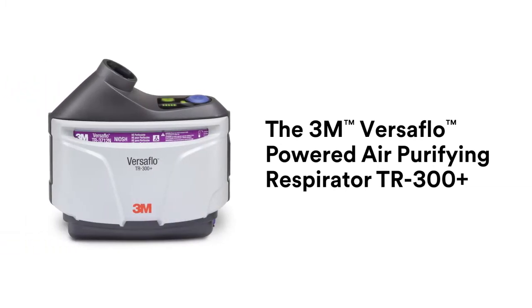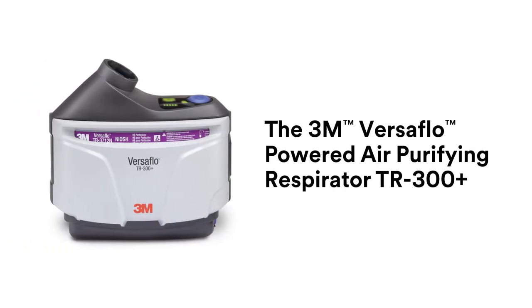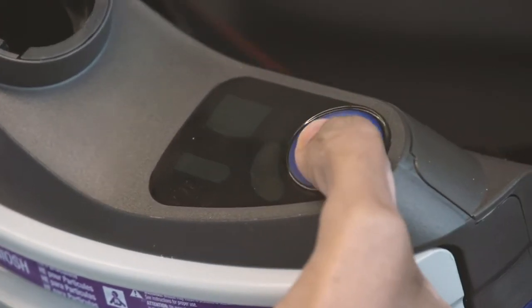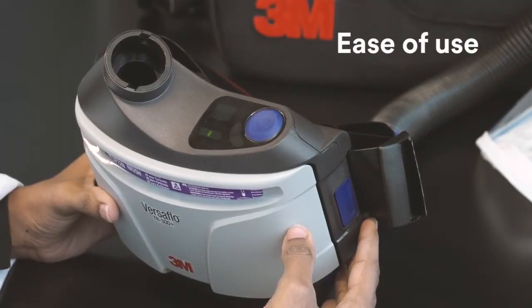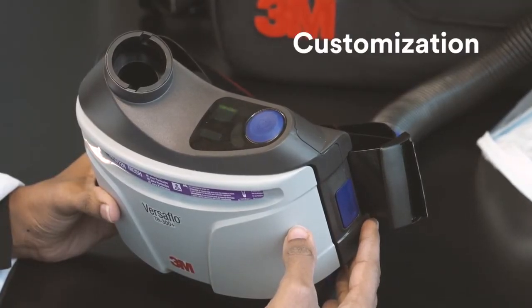Introducing the new 3M Versaflow Powered Air Purifying Respirator, TR-300 Plus — a versatile respirator system for particulate environments that offers ease of use, comfort, and customization.